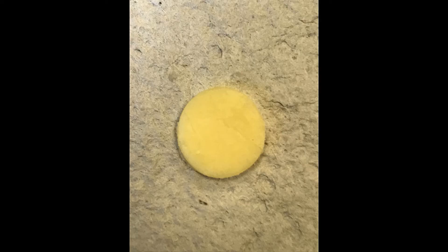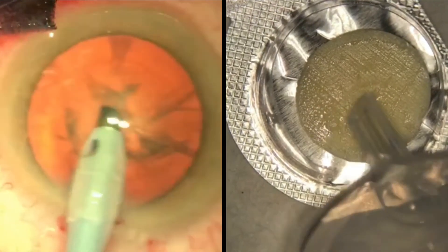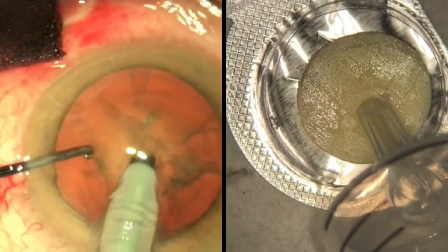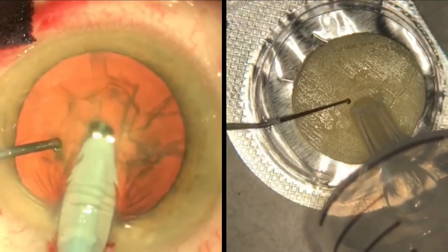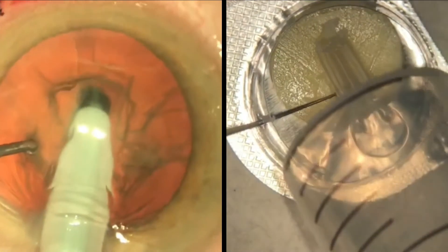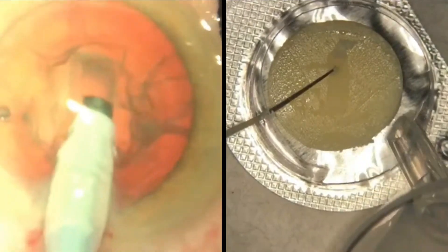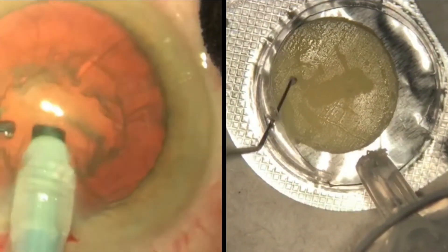The first step in phacoemulsification is sculpting. We have used a disc of soft cheese which fits into our previous lozenge packet and made a further slit in the side of the plastic for second instrument entry. Using the tip of a syringe which has been cut to a 45 degree angle, we made the grooves by advancing and withdrawing the syringe in a similar fashion to the phaco probe. We performed the rotation with the use of our second instrument and also used it to help stabilize the disc.